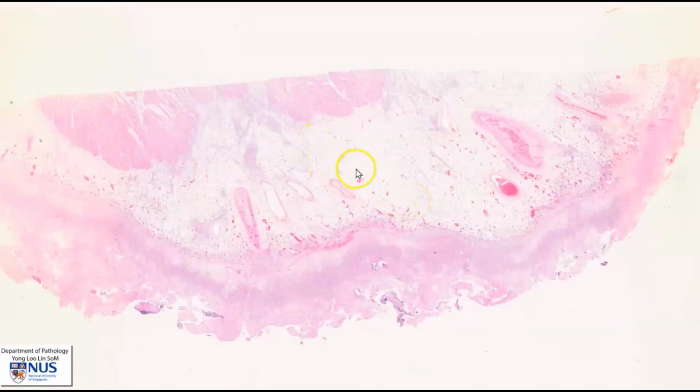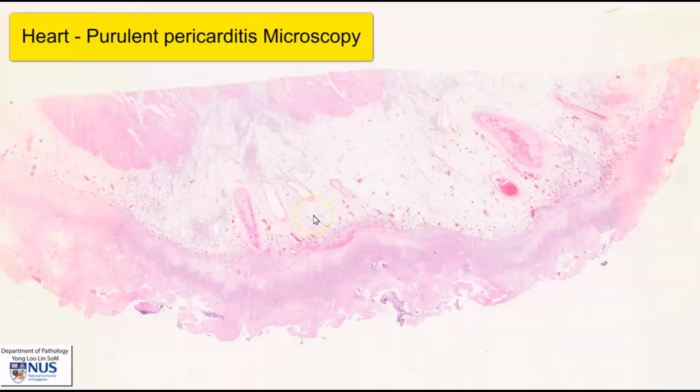Hello, this is a virtual microscopy slide from a case of purulent pericarditis or infective pericarditis. And first, let's orientate ourselves at low magnification.